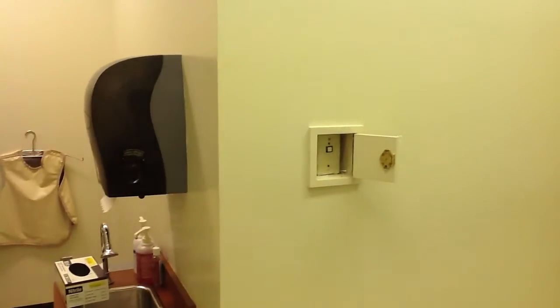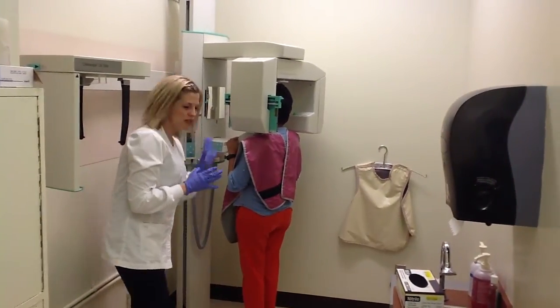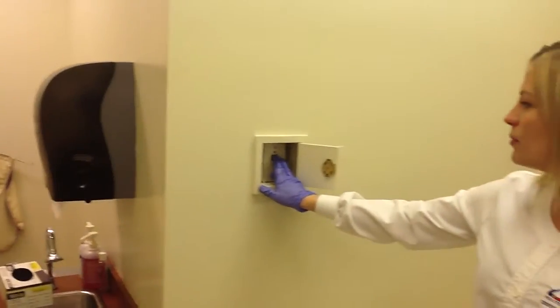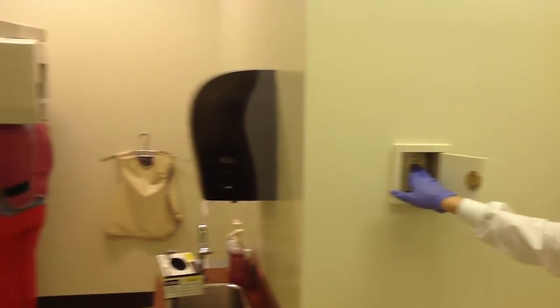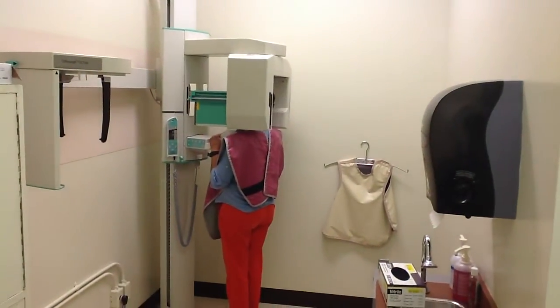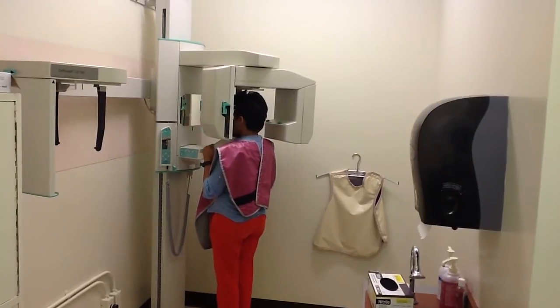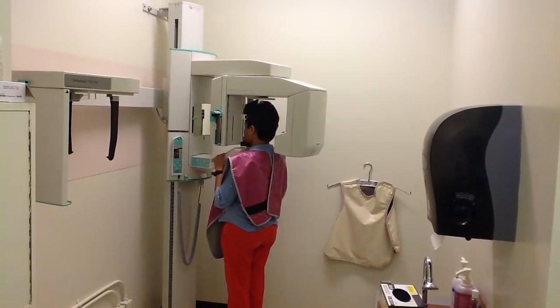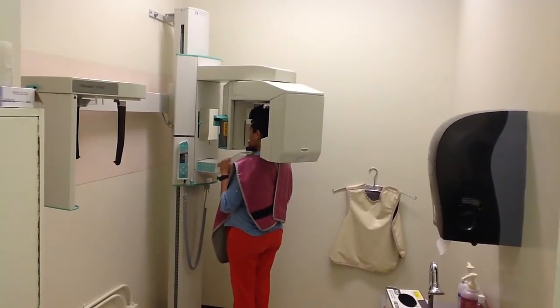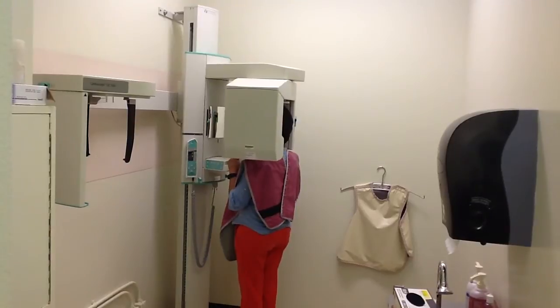So we're going to come out to the exposure button. But for this purpose, obviously we would want to have it on test, such that Fareen gets no radiation today. And we're going to firmly press our exposure button. We'll hold it down the entire time as the tube head rotates around the patient's head. You're doing really well. Keep holding still. We're almost finished.